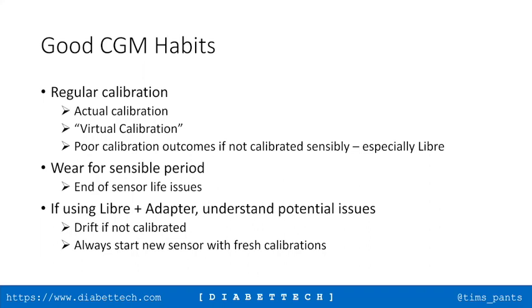For me, I'm using Dexcom G6. Yeah. And I never make calibration. I trust the machine or the instrument, and the good thing is it's calibrated immediately with the loop without my interference. Well, that's fair enough.